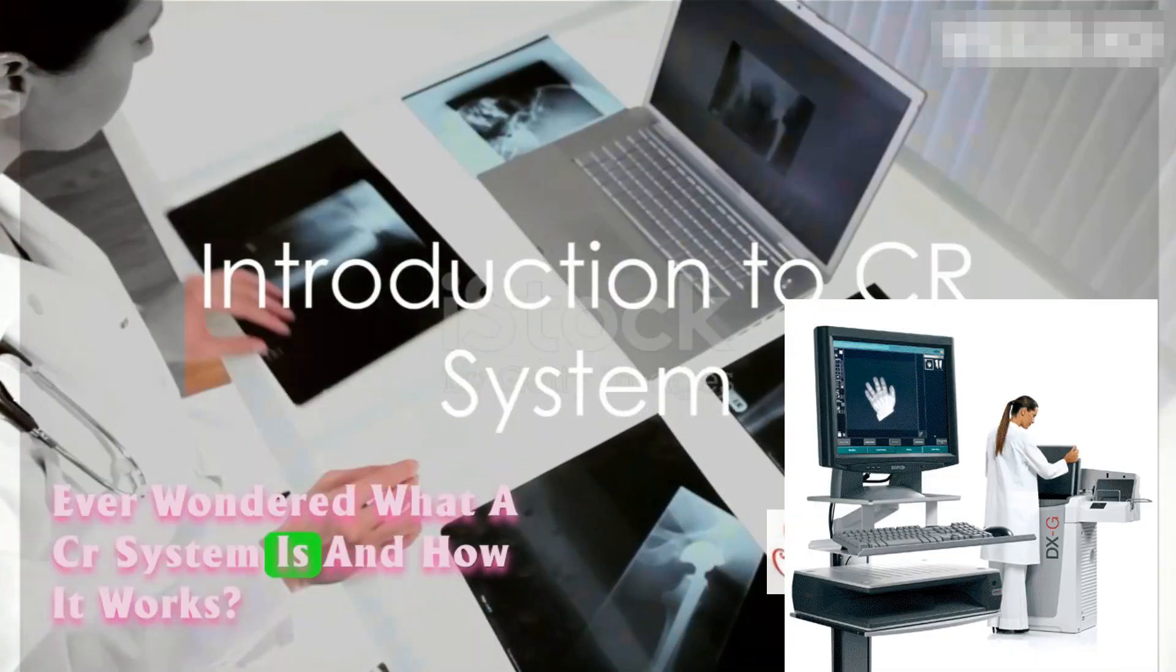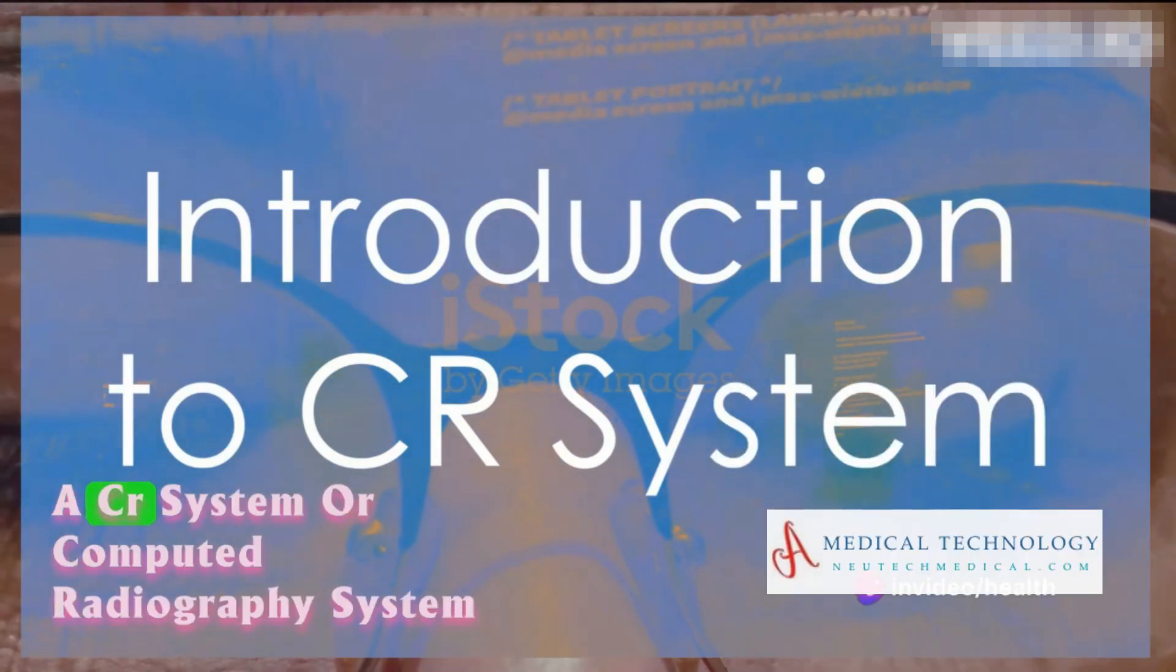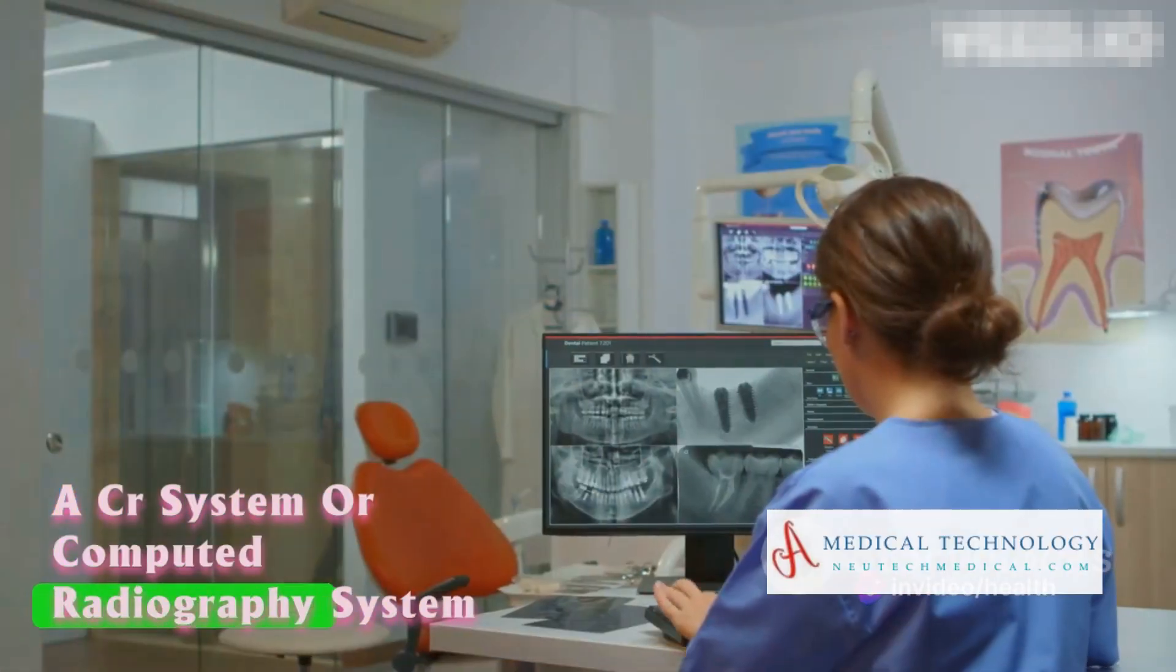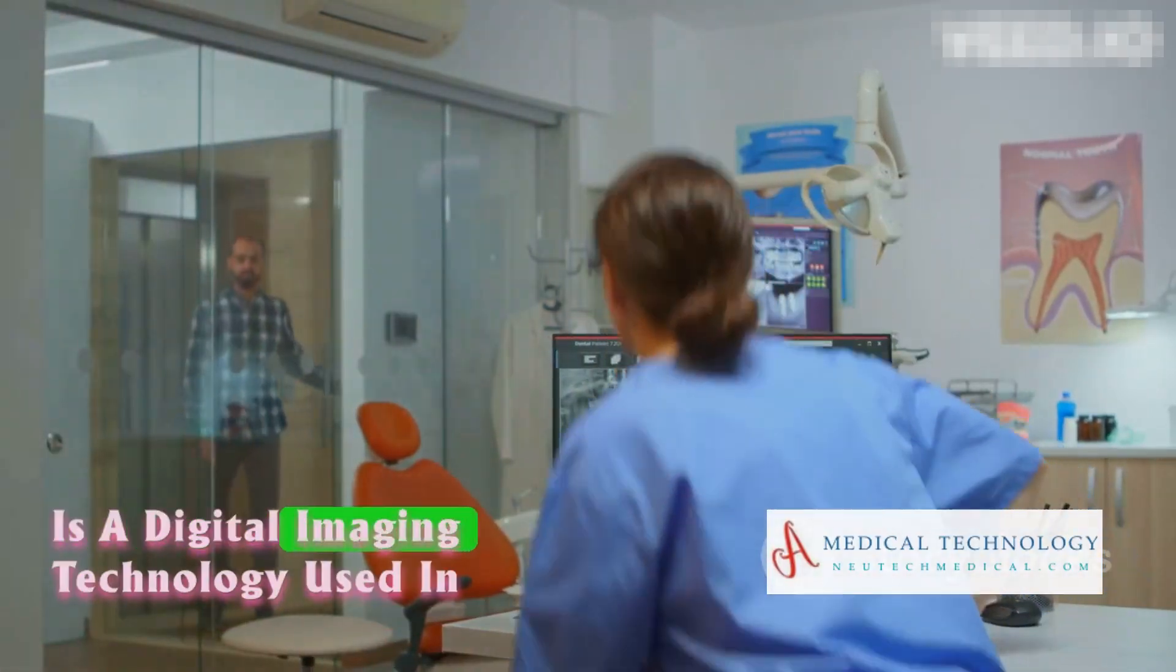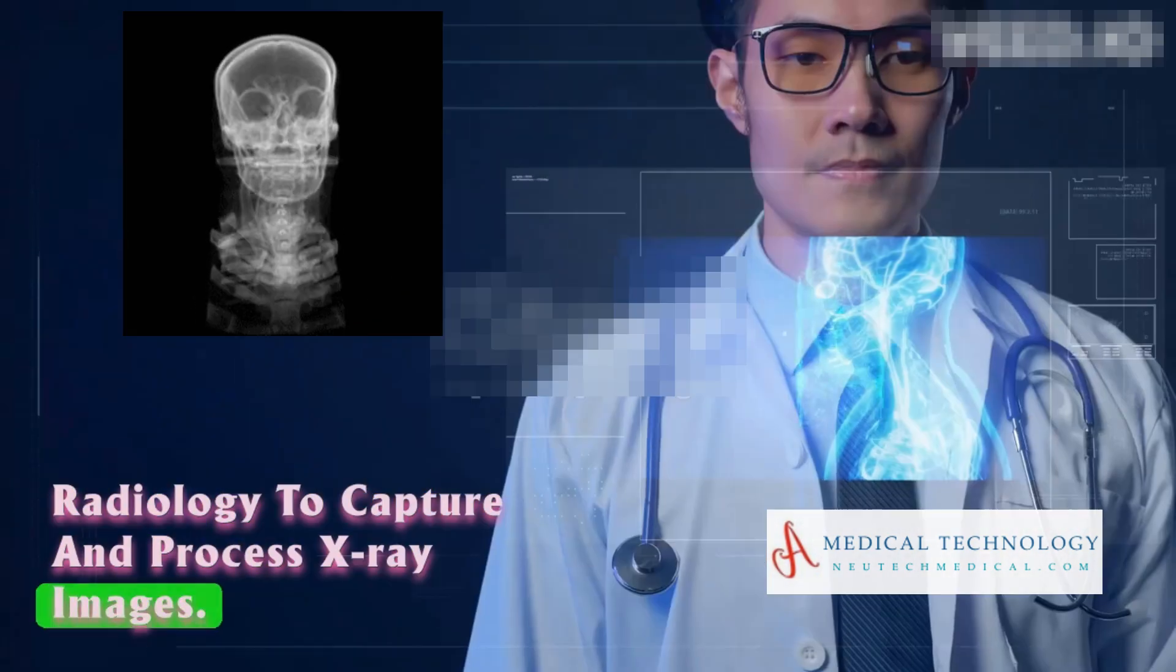Ever wondered what a CR system is and how it works? Well, you're in for a treat. A CR system, or computed radiography system, is a digital imaging technology used in radiology to capture and process X-ray images.